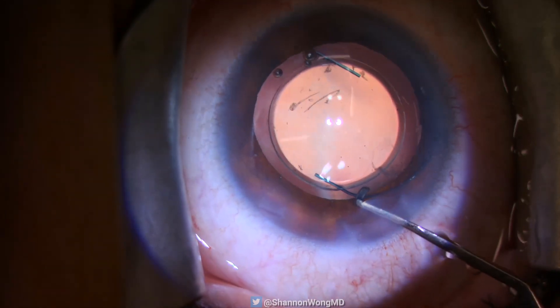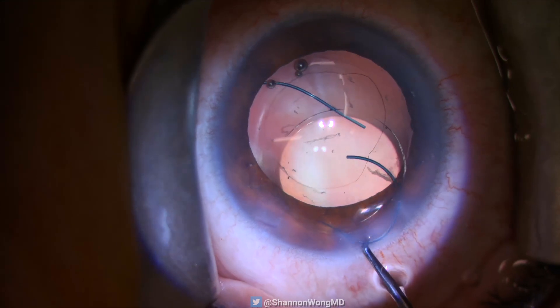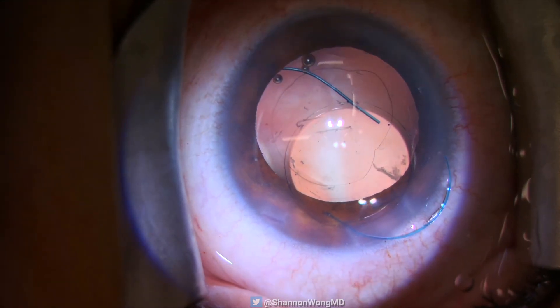So we use our lens chopper to rotate the eye well to bring the bent haptic close to the primary incision, then tease the haptic out of the eye.